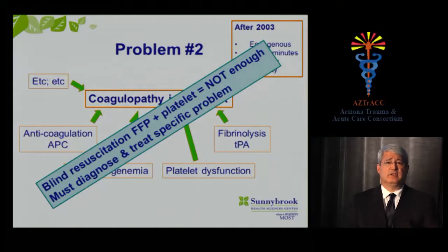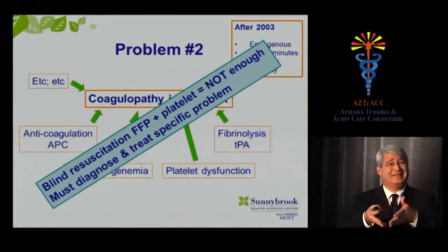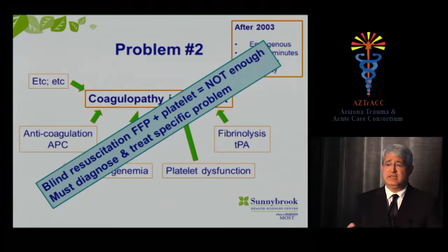and you're not helping your patient. So ideally, what you want to know is: what's the problem? What is wrong with this patient's coagulation? And then you correct that problem. Okay? That's the ideal one.